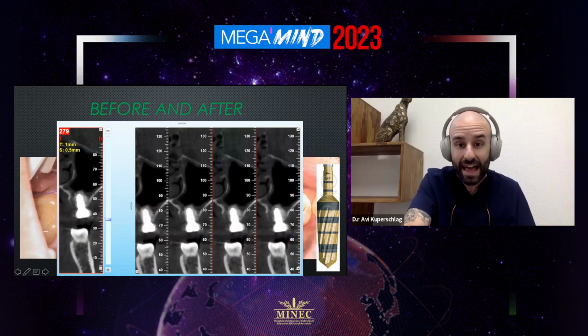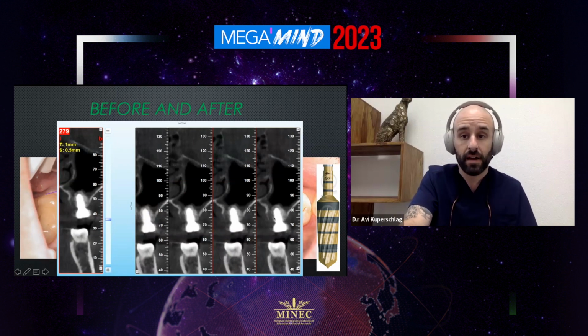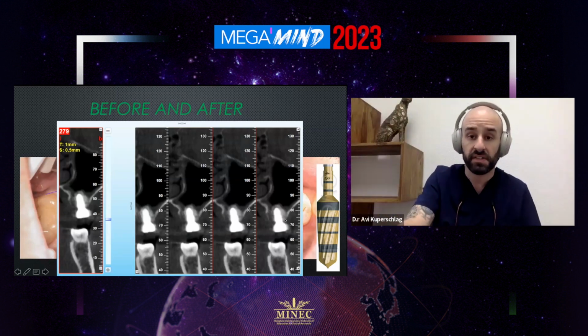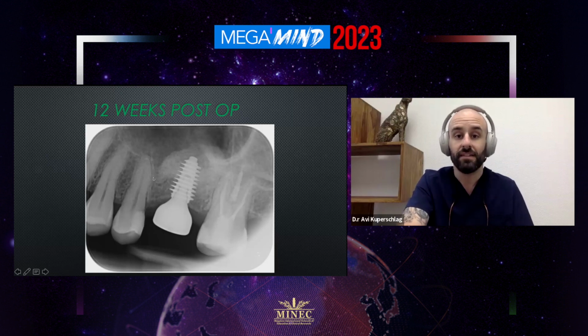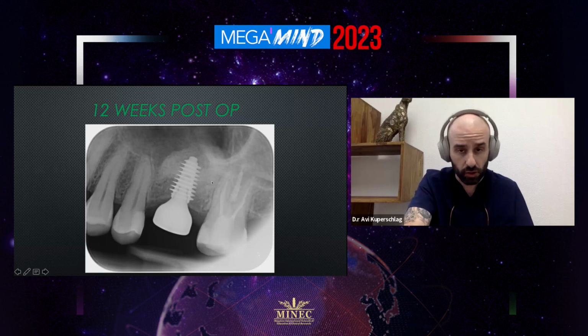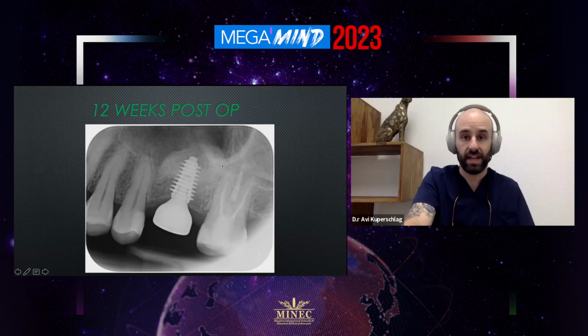As we can see, we have nice elevation and grafting of the entire area from the palate until the buccal. This is exactly this nice canopy that we want to see. And I say to the patient, come back in 3 months. Let's meet again, and we do a control x-ray. The minute that I don't see the old sinus cortex, it shows me that we already have integration of the sinus, but it's not enough.